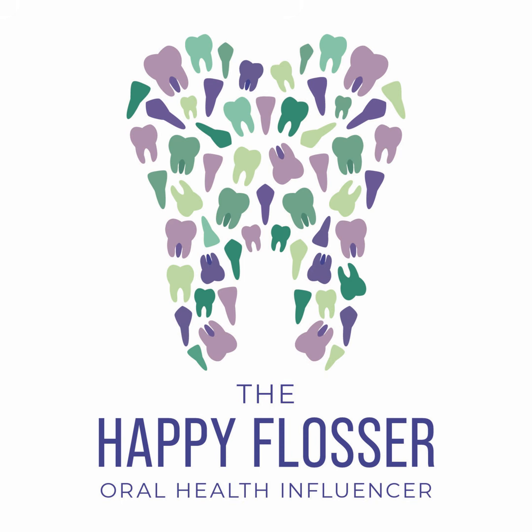And you're going to load quickly and evenly. You don't want to get any air bubbles or overfill your tray because then you're going to actually promote the gag reflex. There's no reason to overfill the tray. You can leave the excess alginate in the bowl. It will set up and then you can just throw it away. It's better to have it in the bowl than going down the patient's throat and getting impressions of their tonsils. We don't need to do that.